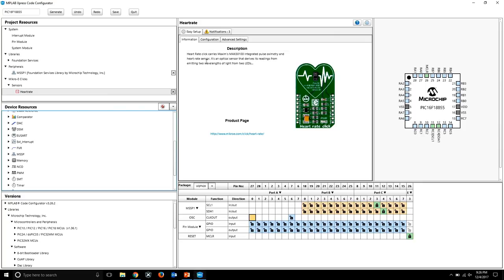If you look under Information, it talks about what this is. And if you click this link, which is Mikroelektronika's website link, it'll take you to their page with all the information, the data sheet and schematics, in case you want to figure out what pins go to what. And once I selected that, another interesting thing happened.